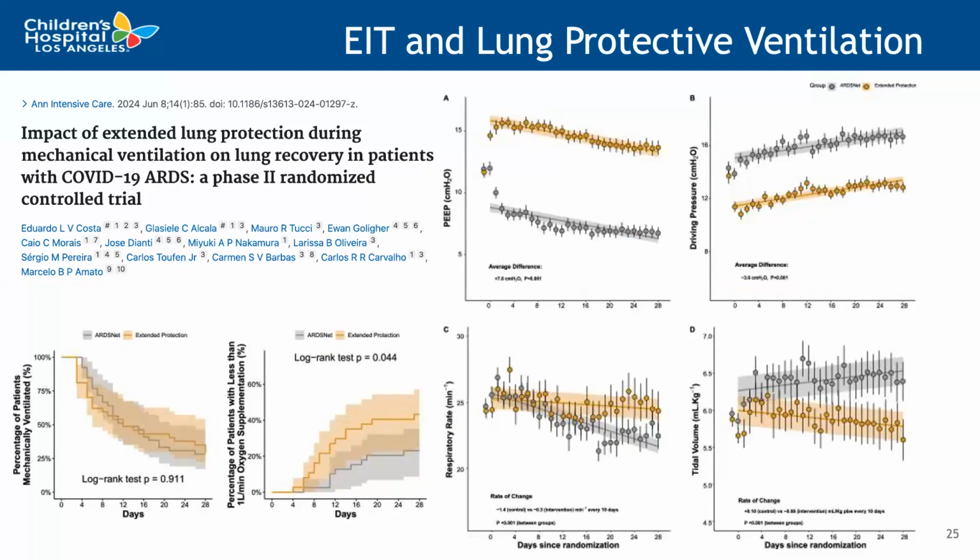And what they found is that the patients in the EIT guided management arm had generally lower driving pressure, generally higher PEEP, and then lower tidal volumes. And so generally were managed with a more lung protective ventilation strategy.